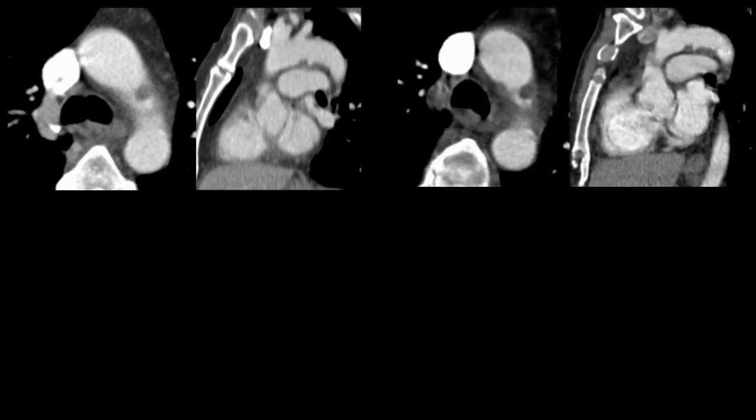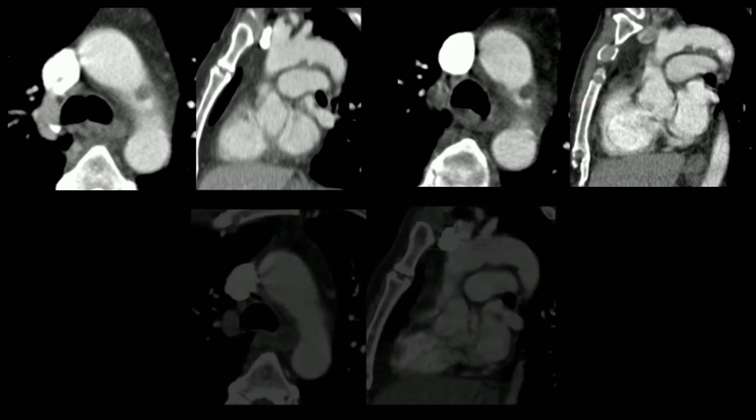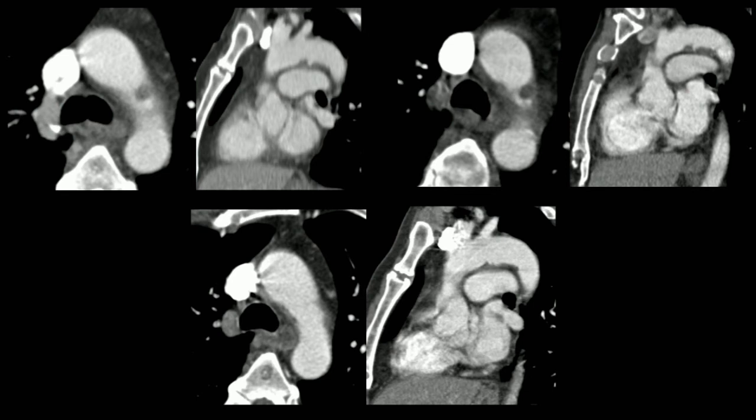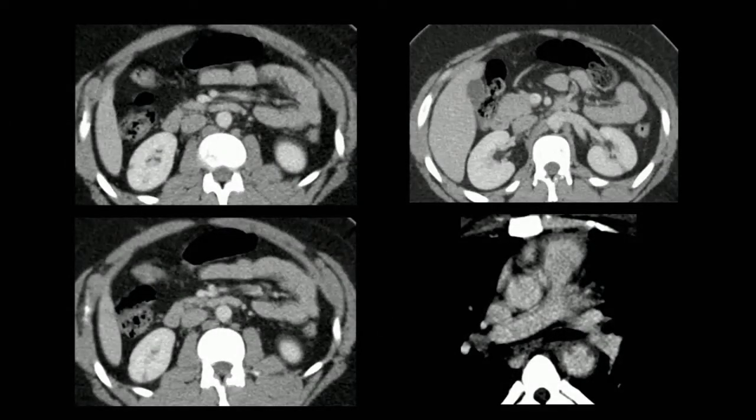Sometimes these injuries are tricky. This patient had what looked like a thrombus along the undersurface of their aorta, but they had atherosclerotic disease elsewhere. On multi-planar reconstructions, it looked like the thrombus was somewhat fissured. We initially favored this was atherosclerotic disease, so we followed them. At one week and one month, it looked the same. Ultimately, six months later, this finding resolved, and the patient was only on aspirin, so it probably was an acute traumatic aortic injury.